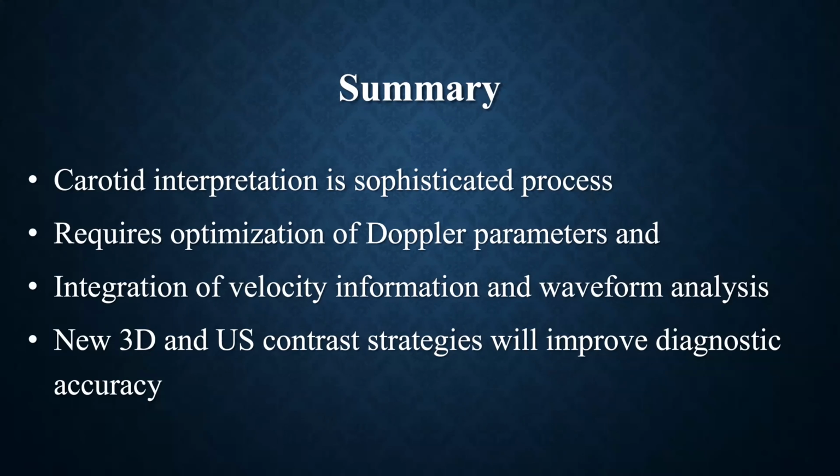And recognize that there are new 3D and ultrasound contrast strategies we'll be using in the future to improve diagnostic accuracy. Thank you all. Thank you, Harp. Hope everyone's doing well, and appreciate your time.